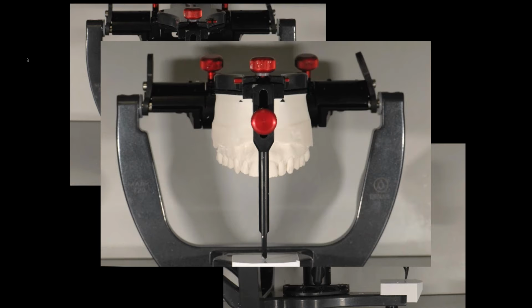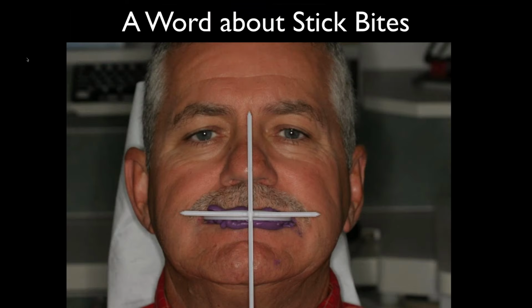And again, the use of that ensures that the occlusal plane will be perfect in the articulator, so we can use it as a tool to make our crowns perfectly level and make the midline perfectly straight up. But if we have to do correction, this is no good, because we've got to see where it's coming from. And that takes me into a little word about stick bites here. I'm sure everybody has seen stick bites and they know what we're talking about.